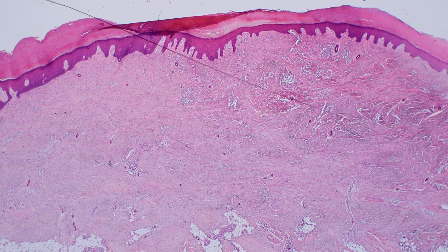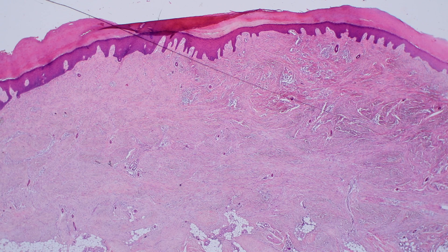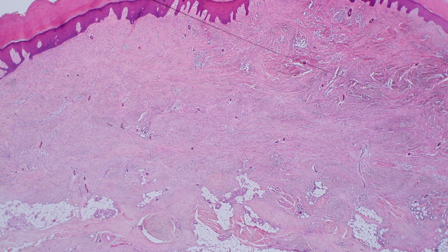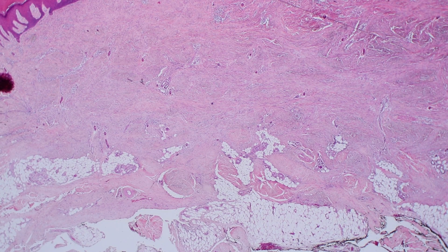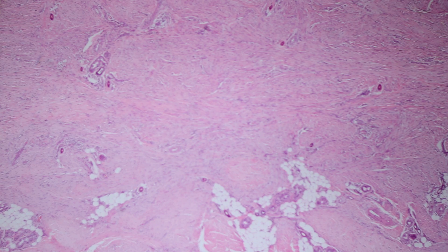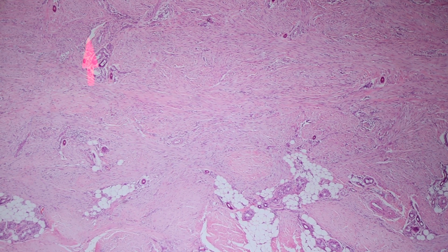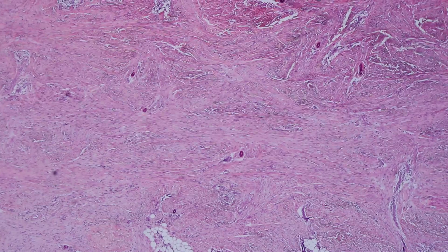The name tells you what you're going to expect to see here. Inclusion body fibromatosis — first of all, it's a fibroblastic proliferation that fills the dermis and sometimes extends into the subcutis. When we go down to higher power, what we see are fibroblasts running in these fascicles, fascicles that are weaving back and forth with one another. You can see where the name fibromatosis comes from.